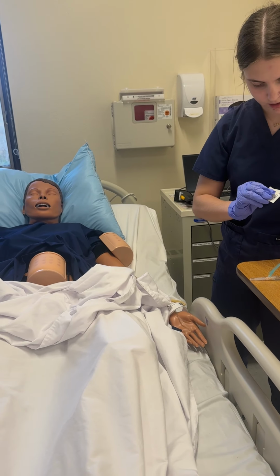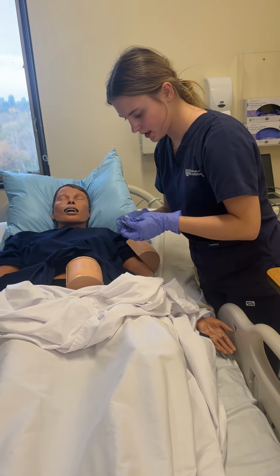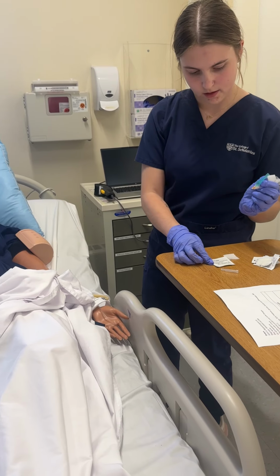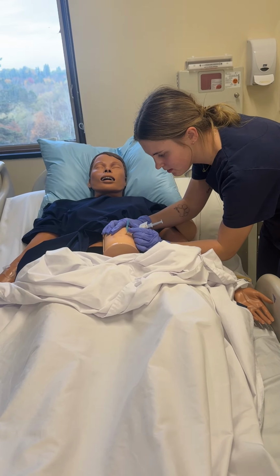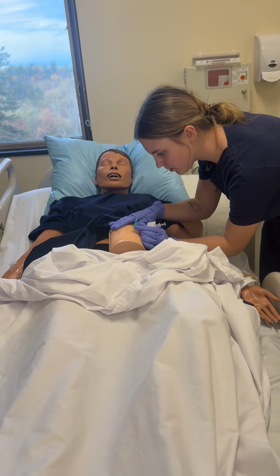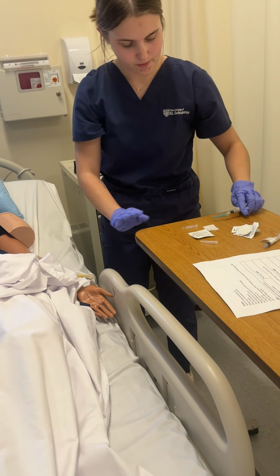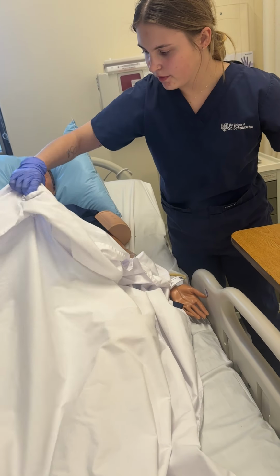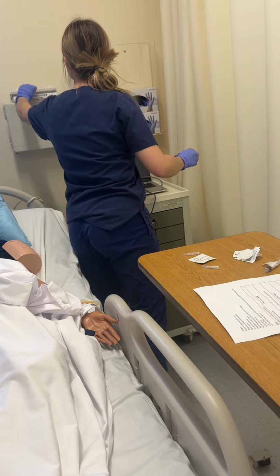We're gonna clean the site here. Let it air dry for a second. Okay. This one we're gonna go in at a 45-degree angle. Administer that medication. Pull it straight back. Put the safety cap on. We're gonna put a Band-Aid over that. Provide the client with some more privacy there. Put this in our sharps.